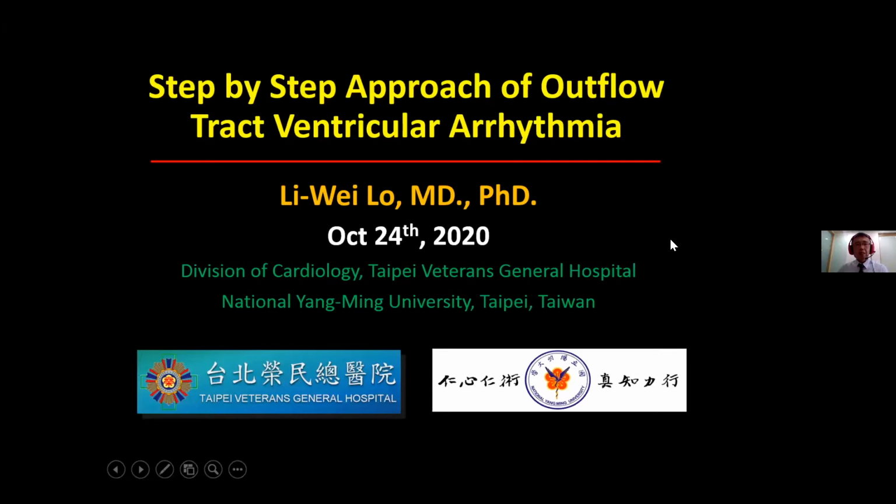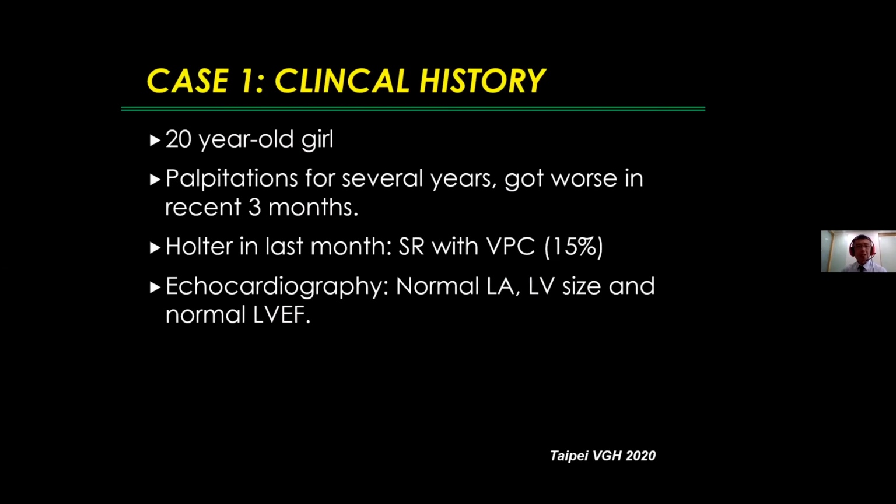Good morning, everyone. Today I would like to talk about two cases of Outflow-Tract ventricular tachycardia and how we identify them from the EKG, what we will do during the procedure, and the ablation details for these two cases. Going to the first case, this is the clinical history.